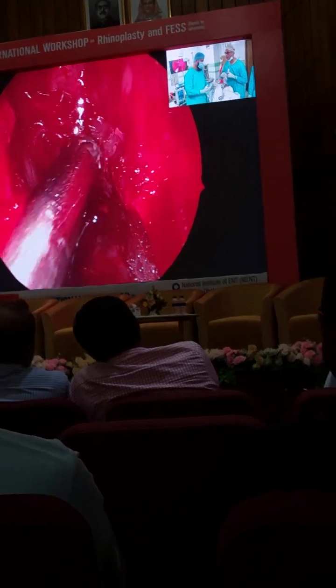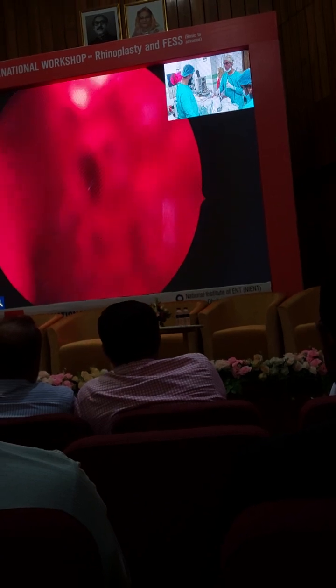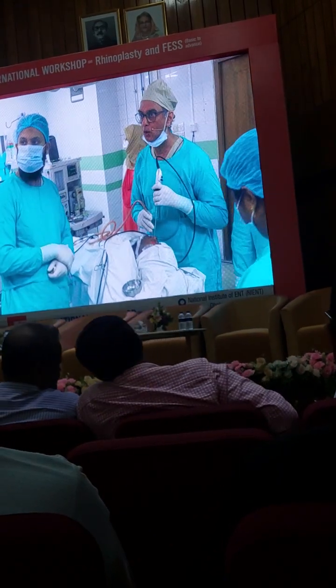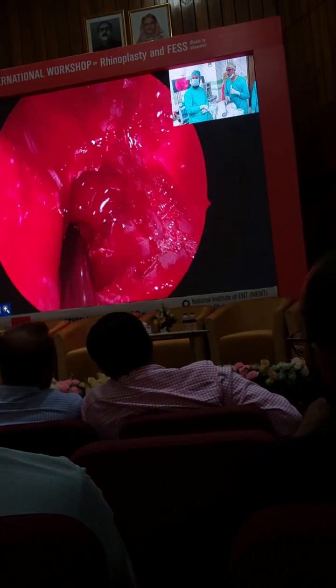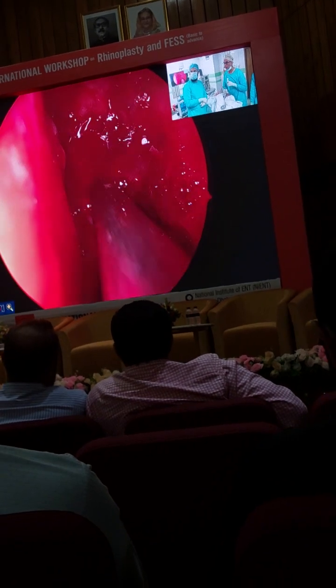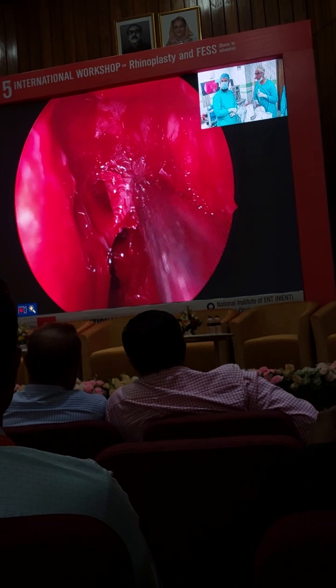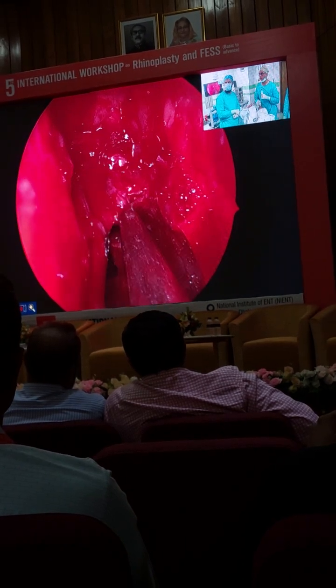Okay. So now let us assess what we have left and see which areas we still have got to go higher. But because it's polyposis, you want the skull base defined all the way from anterior to posterior. Okay? So now we have skull base in this anterior part and in the posterior part. So I know there's a cell here, right? Curette.